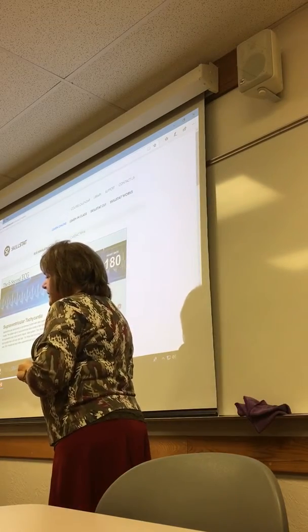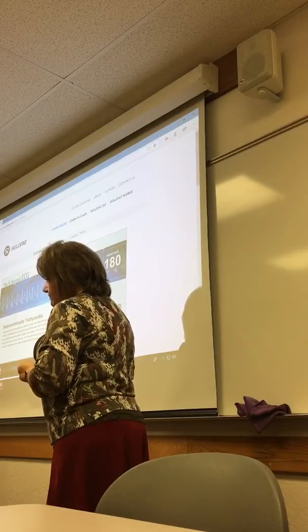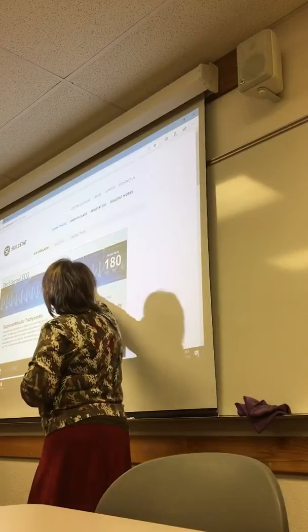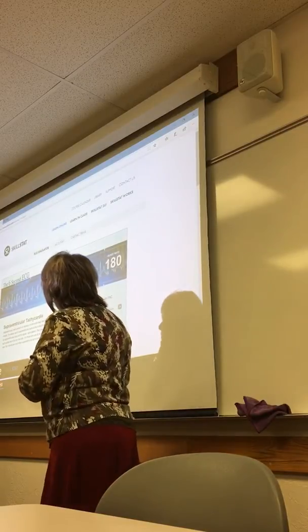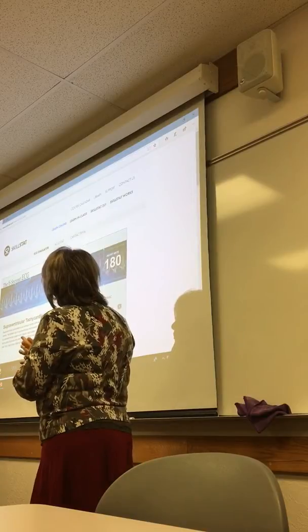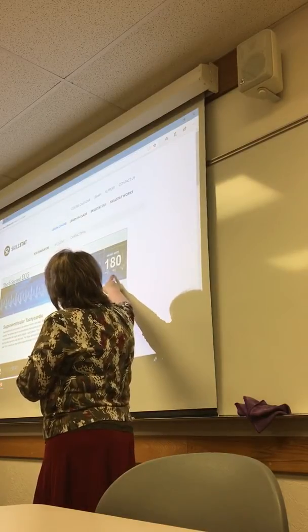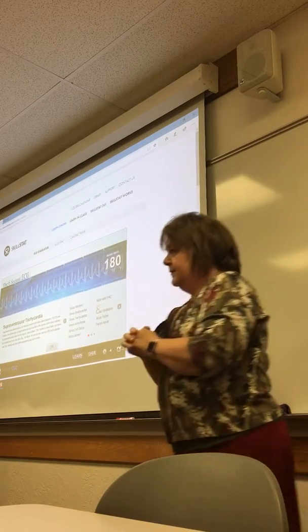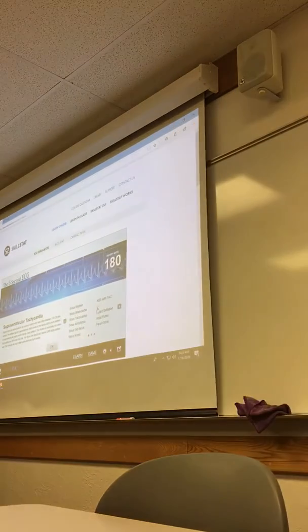Nicole, go ahead. Oh, sorry, when we were talking earlier about the P wave being mixed with the T wave, is that what this is? Yeah, you've got the two of them together, because it's just so fast. There are a lot of tachycardias, we'll show you several of them. The telltale for SVT is that you've got a narrow QRS. So above 150 and narrow QRS.